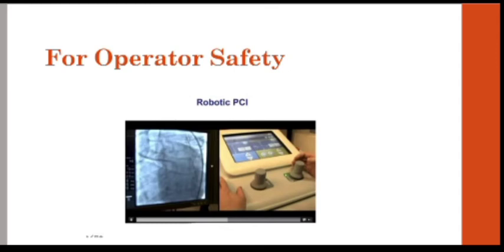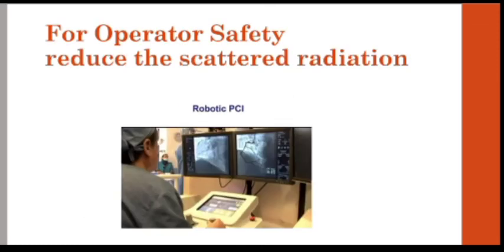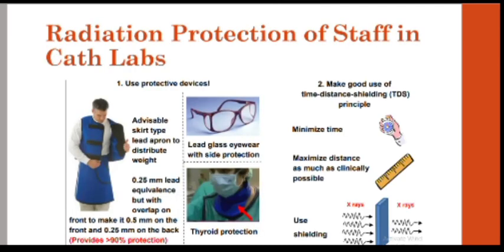For operator safety, robotic PCI is being promoted. For operator safety, reduce the scattered radiation through robotic PCI.